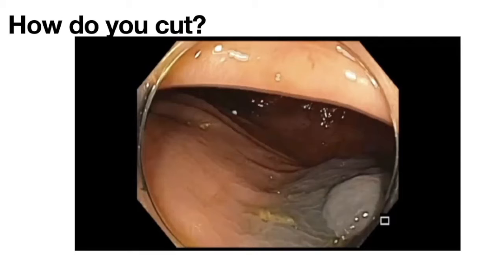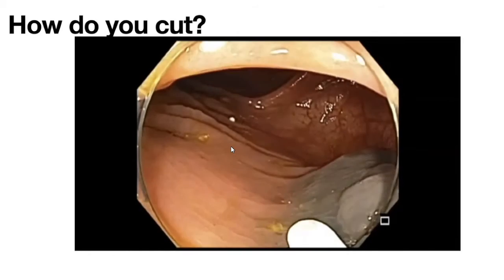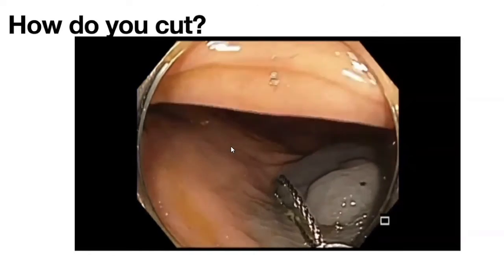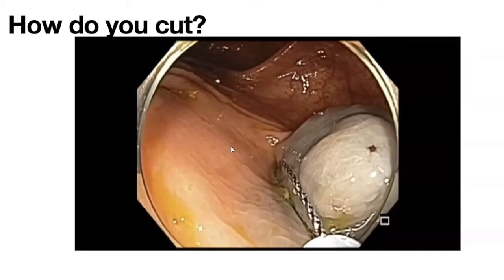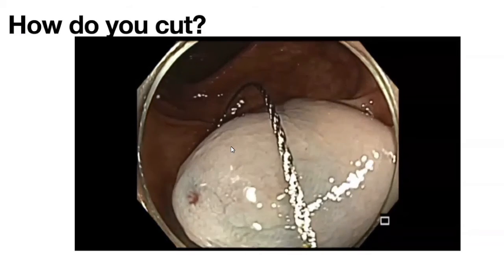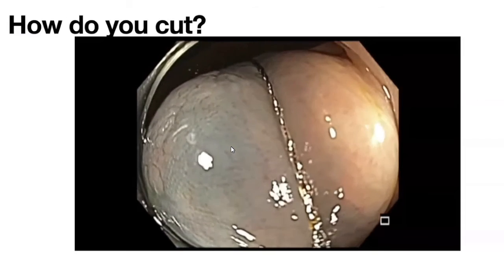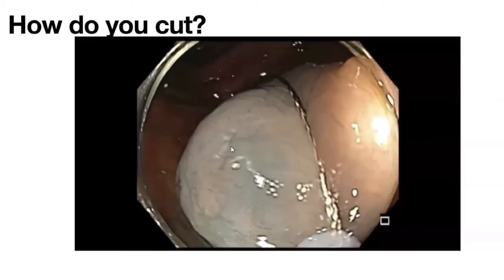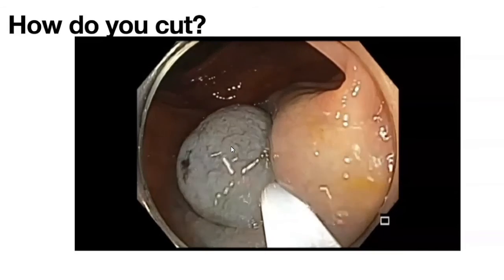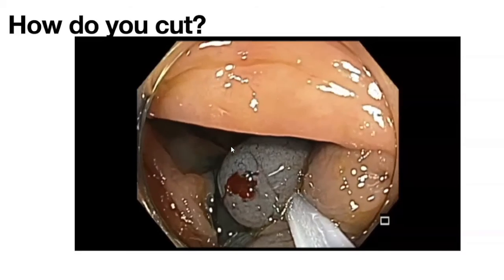Endocut. Okay. So what I did was, I actually used a 15 millimeter snare because I was not sure. Usually, if the snare is like a vertical thing, I ask the assistant to slowly open and turn my scope. If the snare is vertical and you have a nice mount, it is very easy to cut by actually rotating your scope. You don't have to see if the snare is flat and then try to put it on top of it.